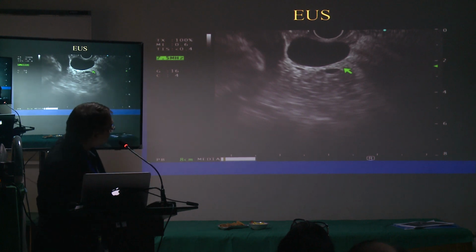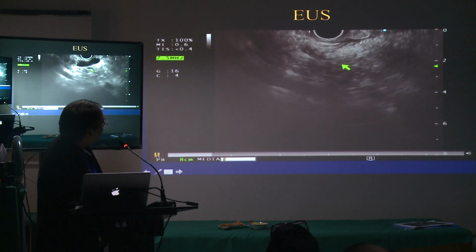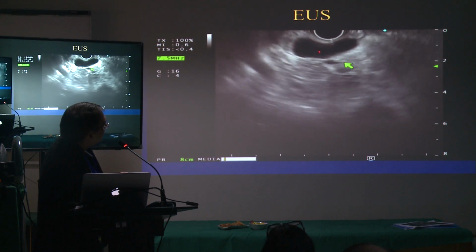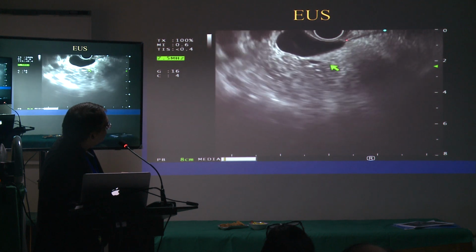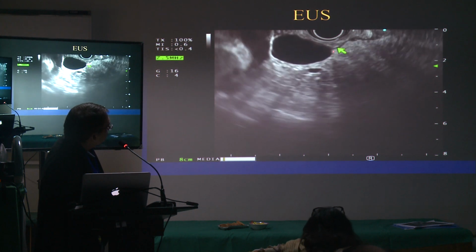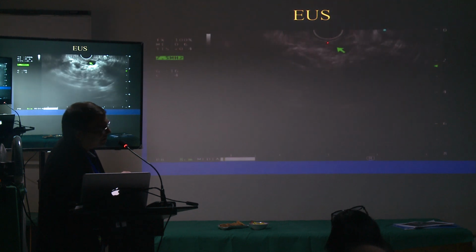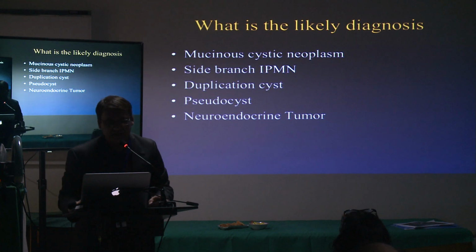One other thing strikes a little bit. If you look at the wall, I think this here is the submucosa and the muscularis propria here. So this cyst is kind of involving that wall too, doesn't it look like? Okay, so let's go through the whole image. Duodenal wall, right here. Muscularis right there. And I really don't see any pancreatic tissue above that, right? So bottom line is like here.